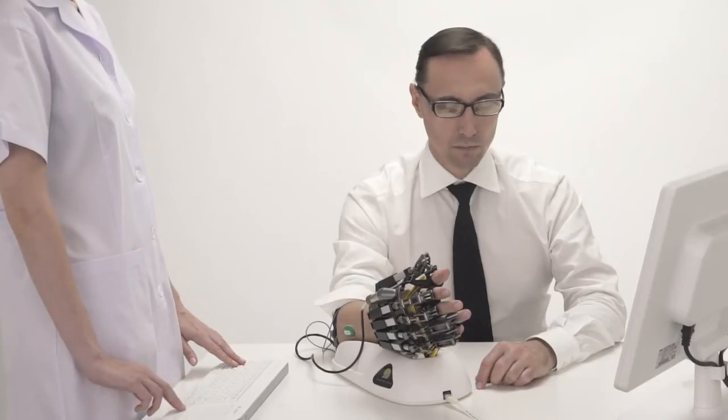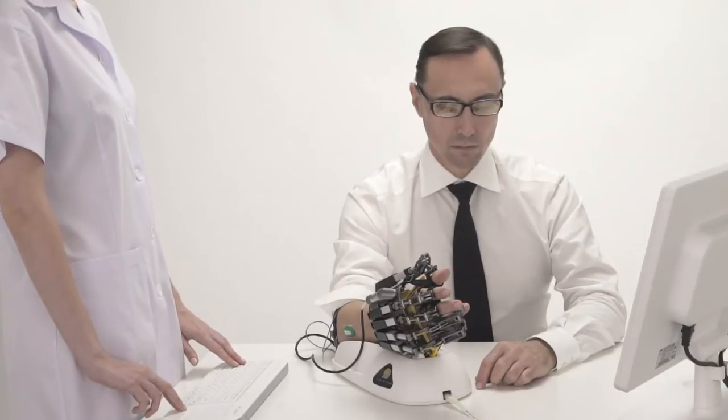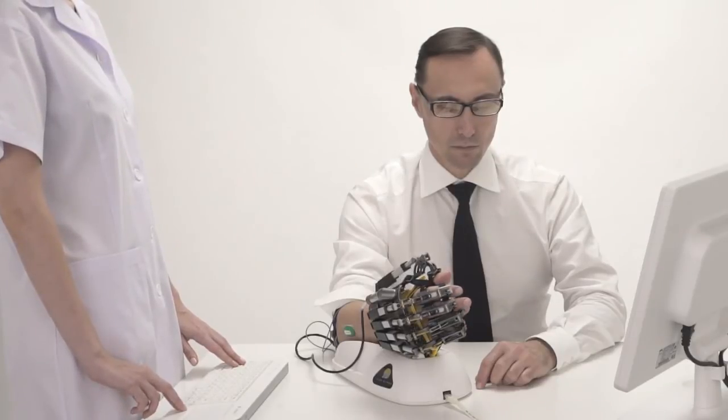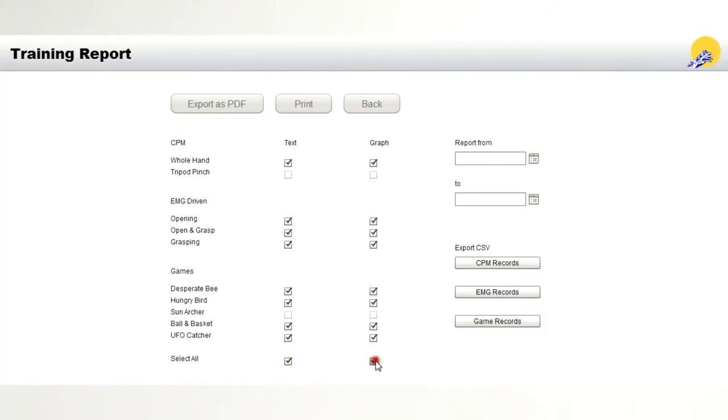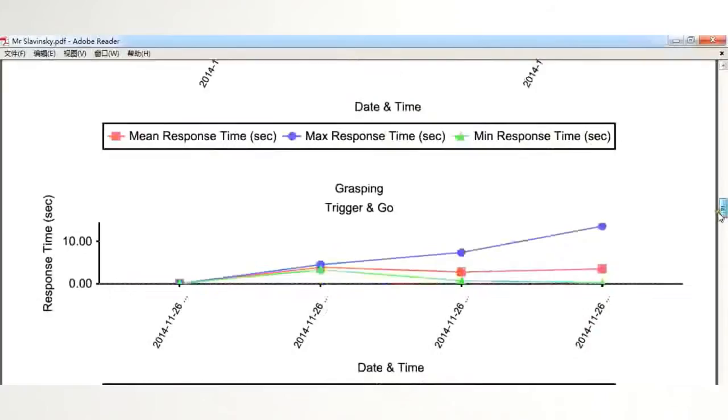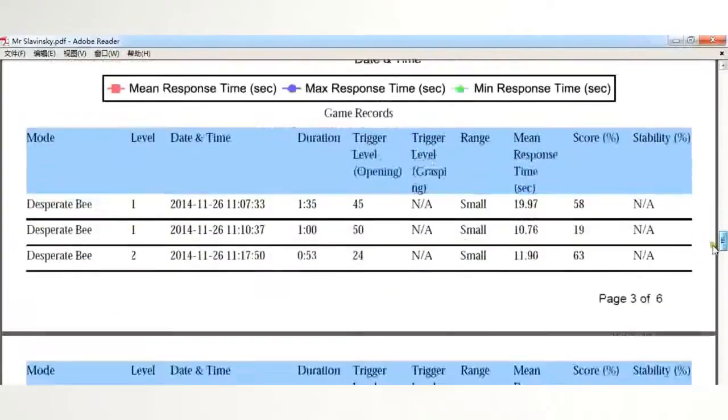Thanks to forearm support, the therapist can use the Hand of Hope for the whole arm recovery on different stages of rehabilitation. Also, therapists can easily extract the report on patients' performances in PDF or Excel file.